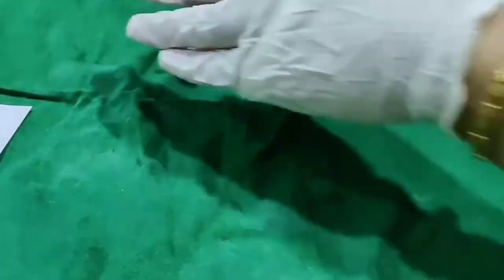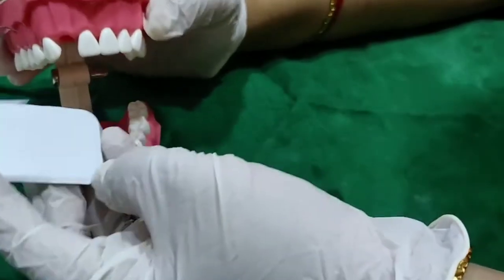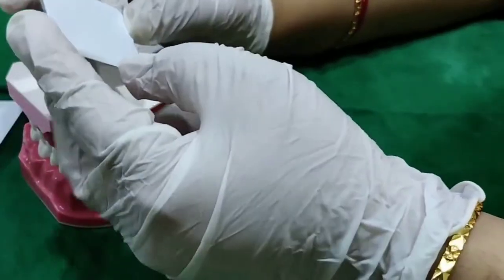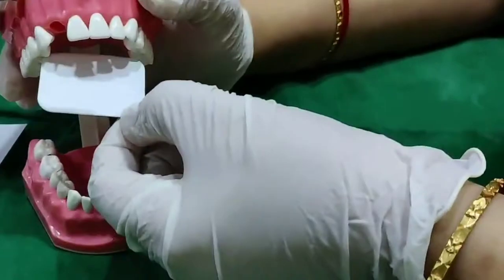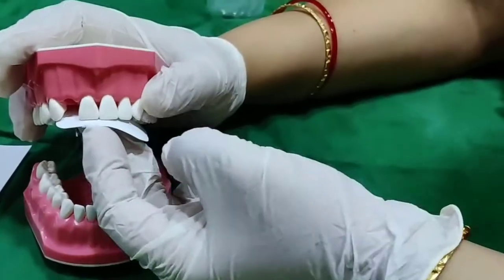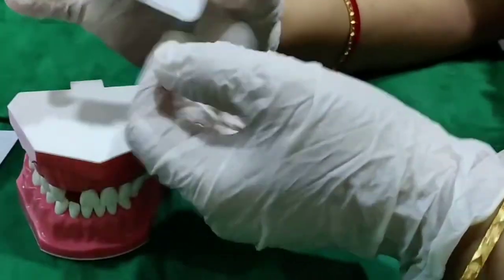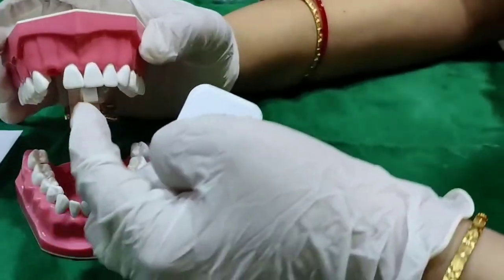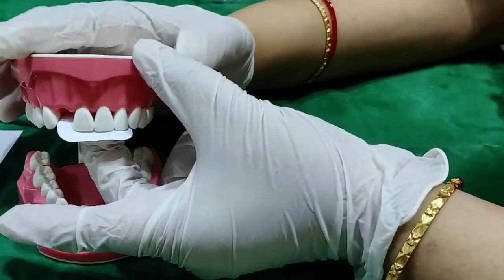For film positioning, if you're looking at the upper front tooth, this should be the area of concern for radiation positioning, and the raised dot should face toward the area. If the crown height and root length are more, you can change the film from horizontal to vertical orientation. In horizontal position it covers more teeth; in vertical it covers one or two teeth.